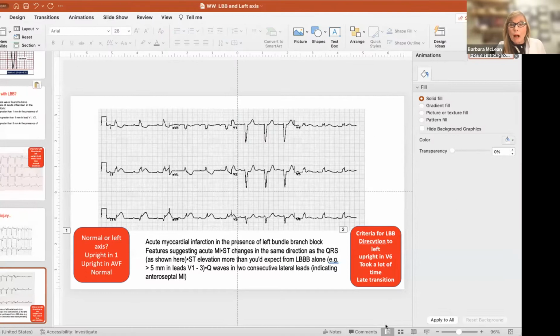So we talked about a lot of things. What I want you to remember, every time you look at an EKG, separate first. If you have time, if the patient's not having a profuse STEMI, which is pretty obvious, not always, but generally, look at your limb leads.